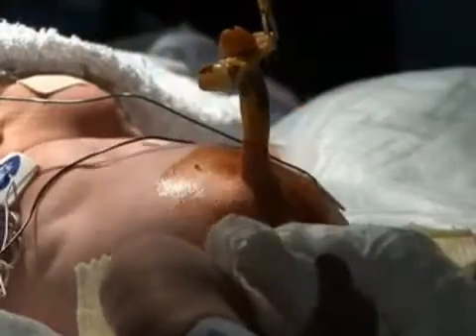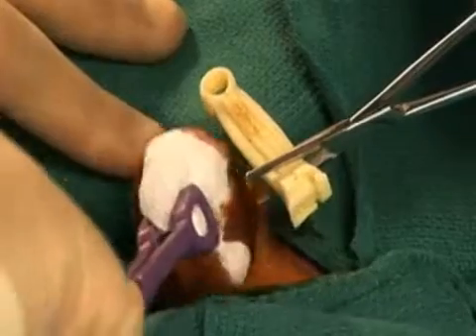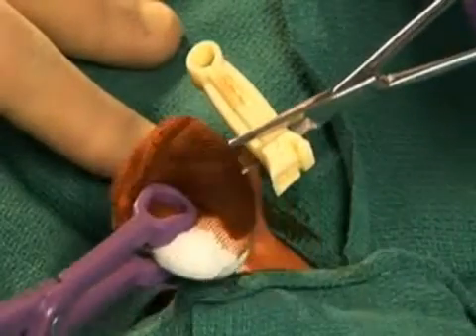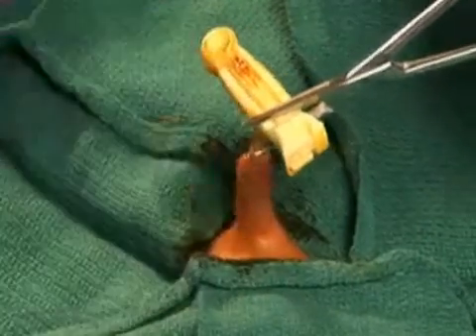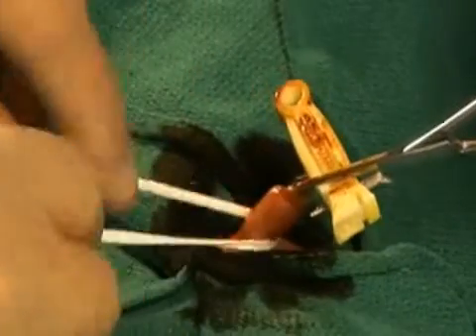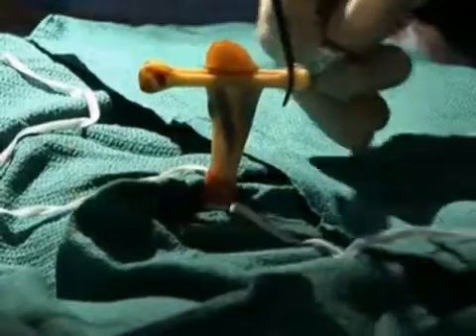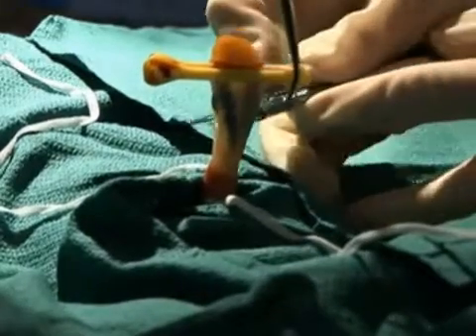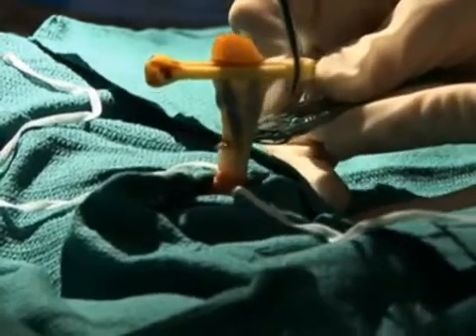Ask an assistant, who need not be wearing a sterile gown, to grasp the cord by the cord clamp and apply traction vertically. Apply antiseptic solution to the cord and surrounding skin. Apply sterile towels or surgical drape in such a way that the patient's face is visible, then wrap the cord tie around the base of the umbilicus and tie with a single knot. The knot should be tight enough to prevent bleeding from the cord, but loose enough to allow the catheters to pass through the vessels of the cord. Cut the cord horizontally with the scalpel, approximately 1.5 centimeters from the skin. Take care not to cut the skin that is at the base of the cord. Ask the assistant to remove the cut cord and clamp from the field.